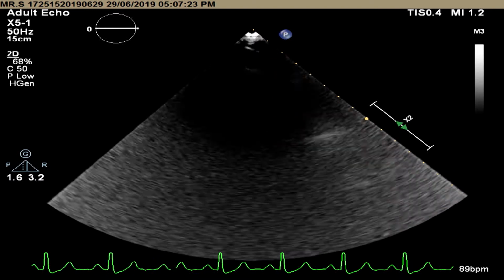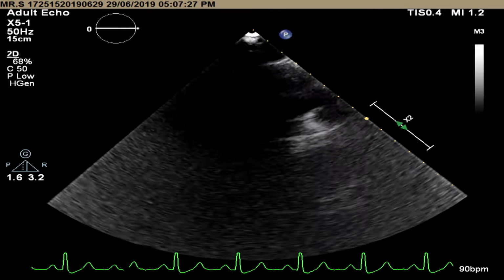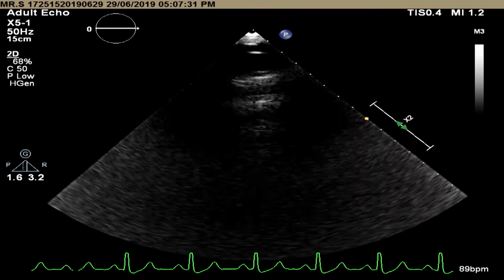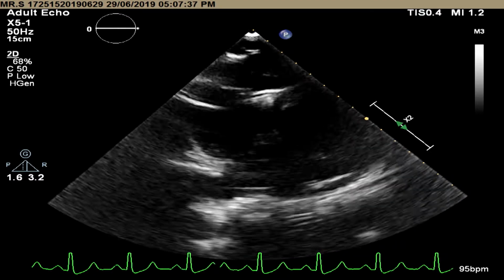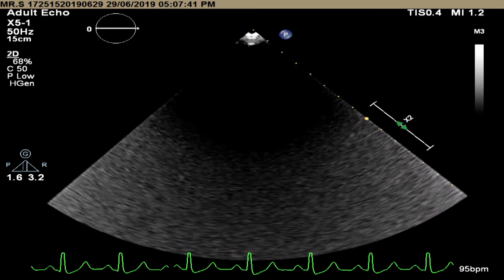Jesse, what else do you look for in echo aside from the LV dysfunction and what the ductal view is? I have to be honest, I don't usually do intraprocedural echo for PDA closure. Shiva, he is saying he is more efficient than you. I agree. Nobody's more efficient than a cath lab in India.